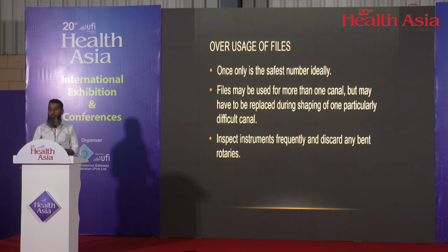So this way, in a combination of anterior and a couple of molars, you can make your file last maybe for 3 to 5 cases or so. But it should not be more than that. Otherwise, like I told you, there are chances of separation. And even doing this, you need to inspect your files frequently. As soon as you see any signs of distortion, you need to discard it.